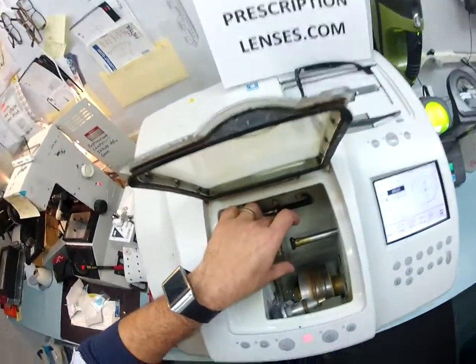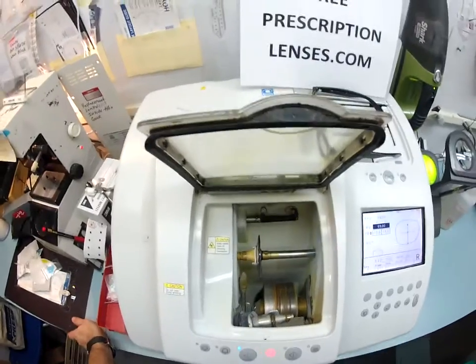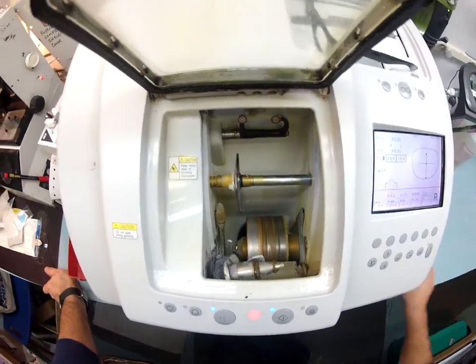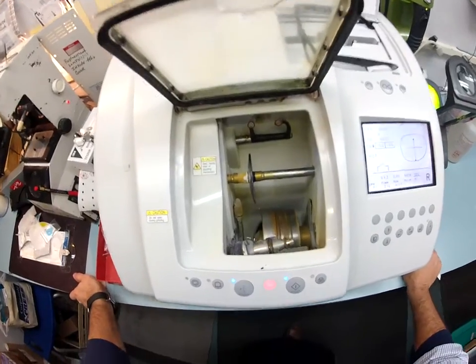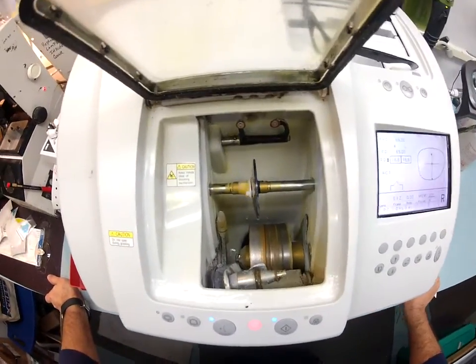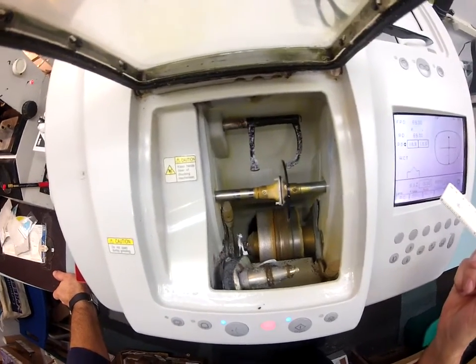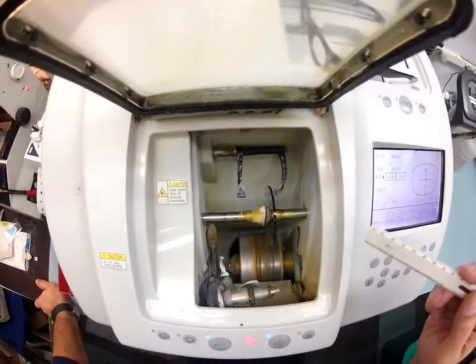Hello Chuck — excuse me, Charles. So the first thing that's going to happen — well, first I have to hit the start button. You would think for $30,000 the machine would just start, but you still have to hit start. It's hard to find good quality help. And I'm a licensed optician here in North Carolina.